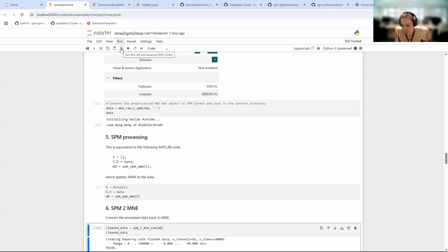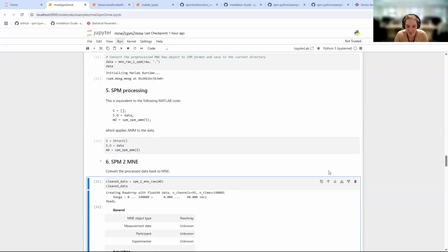So that's important to translate, and this translates the TRA matrix to the data, so it applies the projections right away. I can talk about it later if you have questions, because I'm not explaining it super clearly, but it saves the TRA matrix. That's important, so you don't lose this information. Okay, nice. Thank you, Julia.